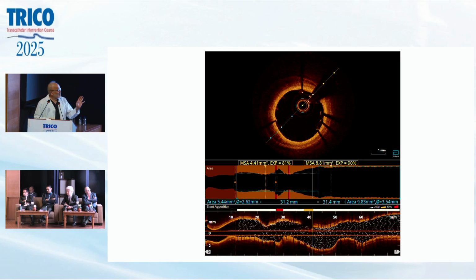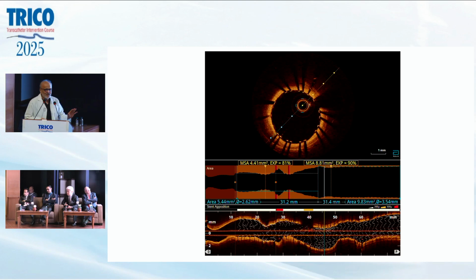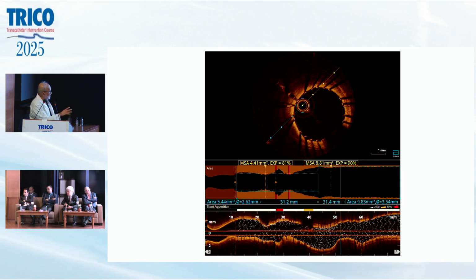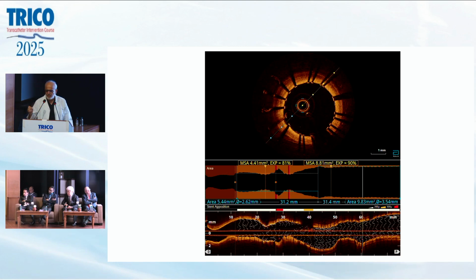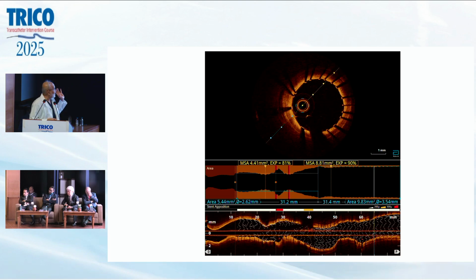So these are the patients. If you get an acceptable good result, which has been confirmed with imaging, you leave them alone. Bring them back after 6 months just to check whether there is any stent malapposition or not, because the hematoma by that time will dissolve, and if the stents are in some places significantly malapposed, you just expand them well, and they will expand.